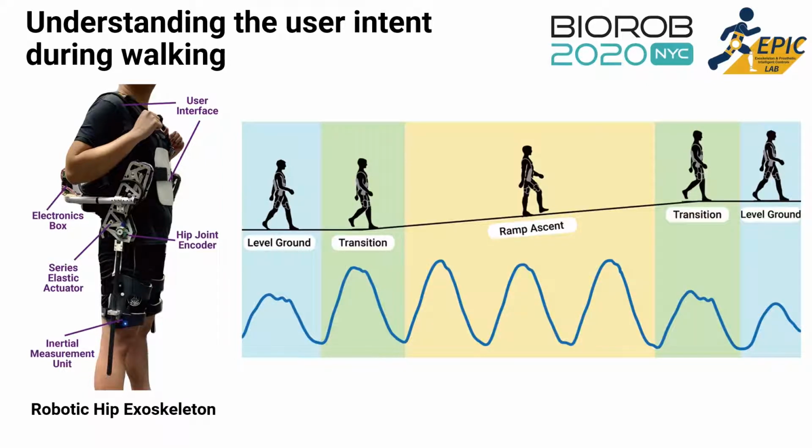A standard method in the literature is that these modes are classified at discrete times within the gait cycle, from a deterministic joint configuration where the data is most reliable, such as heel strike or toe off. However, this could potentially result in delayed and inaccurate assistance during the mode transition period. One thing to note is that during a gait cycle, this kinematic information varies even though the user stays within the specific mode, which makes it hard for the model to classify the user's locomotion mode accurately.